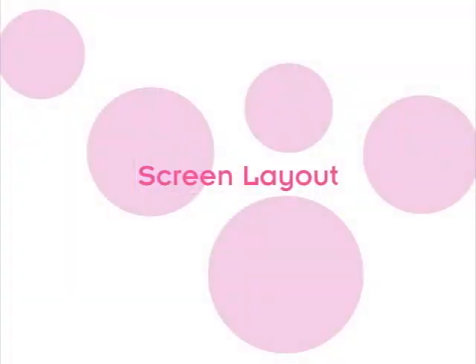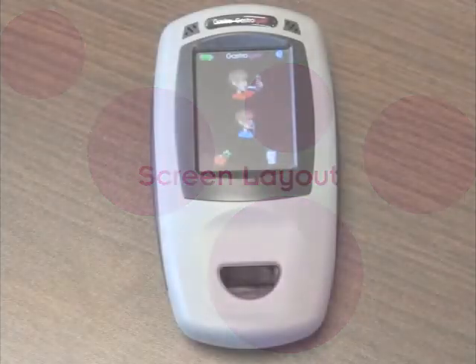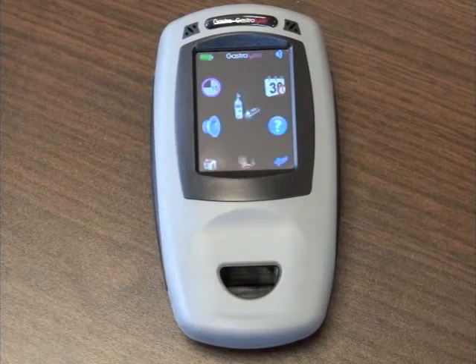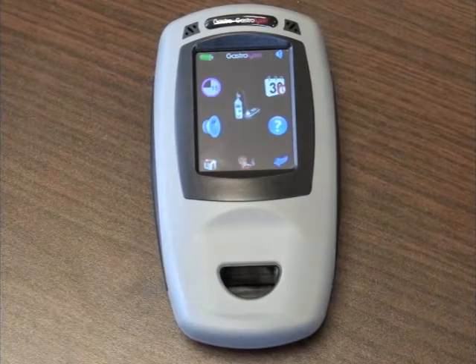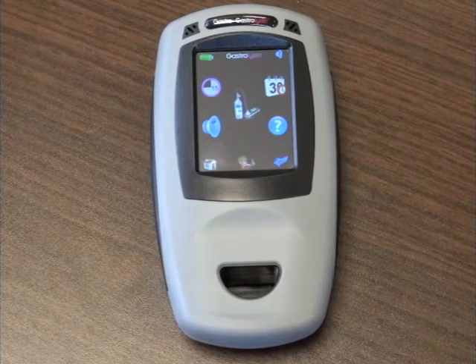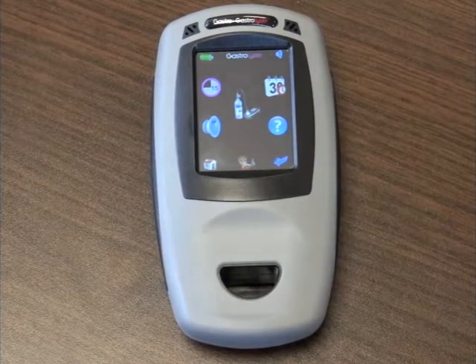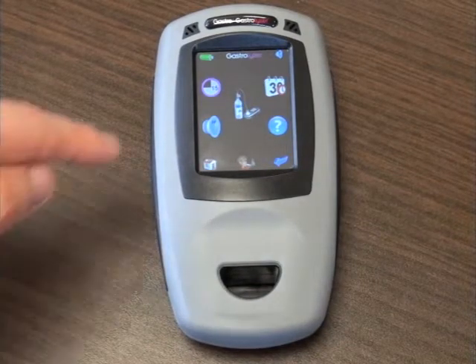Screen layout. From the main screen, press the cogs icon in the bottom left to bring up the options menu. From here you will have several options and features to choose from. Press the speaker icon to mute or unmute the Gastroplast Gastrolyzer.